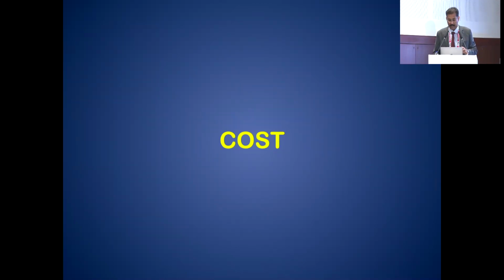femtorexis. And the cost factor is definitely there, and it will be almost double the cost of your premium IOL patient's cataract surgery. That is coming down now, but still it is on the high end. So please choose wisely whether you need to have this to do a rhexis, but it is for completion's sake in a tertiary institute. If patients ask, and you don't have laser assisted surgery, then you should be able to offer this. That's why we have it.